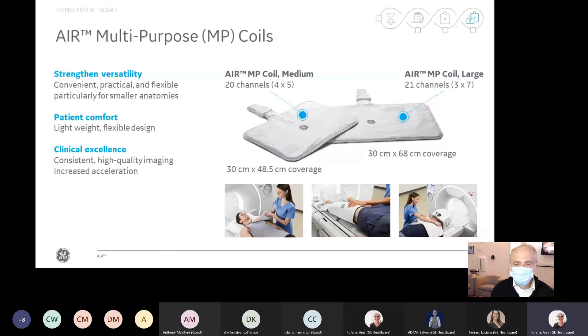The coil we'll be using today is also part of the Air family — very lightweight, flexible, multi-purpose coils. They come in two sizes: a medium 20-channel coil and a large 21-channel coil. You can use these across various anatomies for musculoskeletal imaging — wrist, elbow, knee, shoulder. They work really well for that, and you'll see an example during the scan session today.